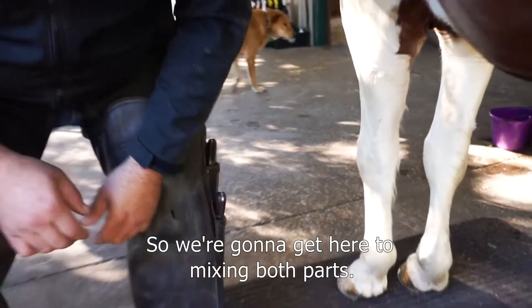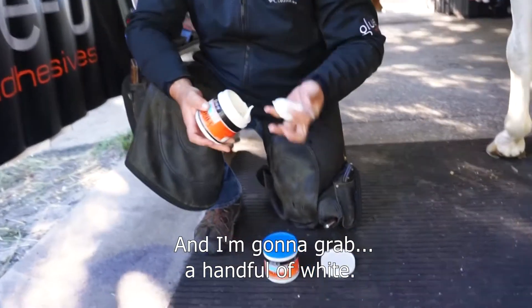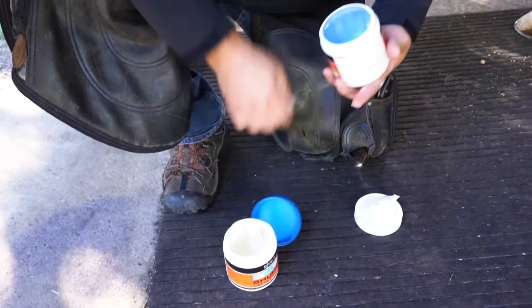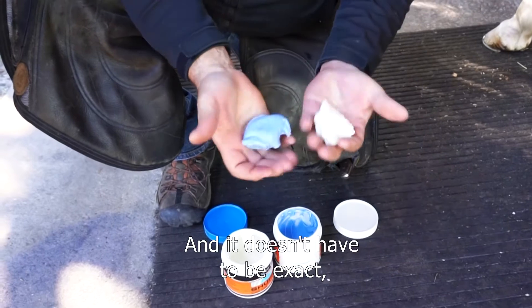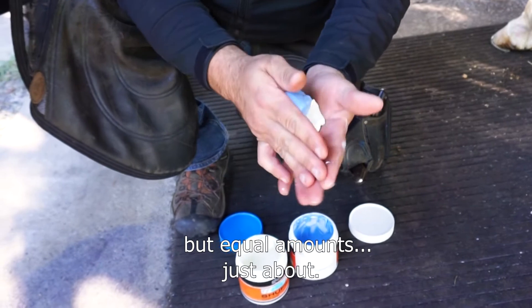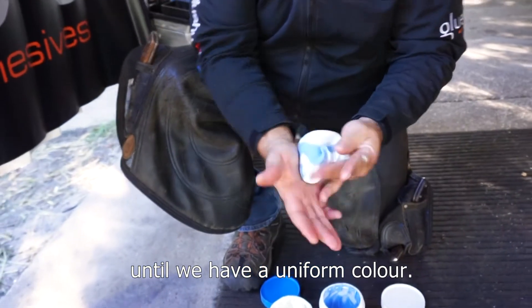We're going to get to mixing both parts. I'm going to grab a handful of white and a handful of blue — it doesn't have to be exact, just equal amounts — and then we're going to work it until we have a uniform color.